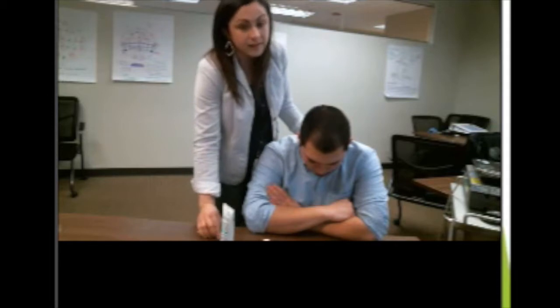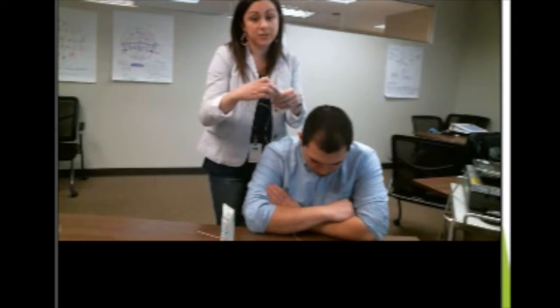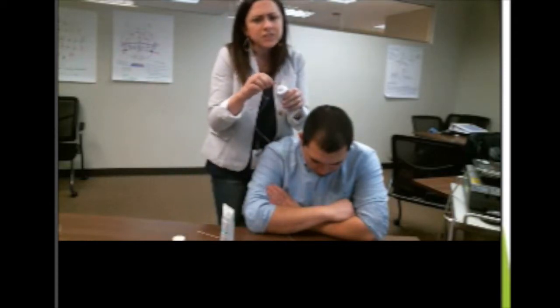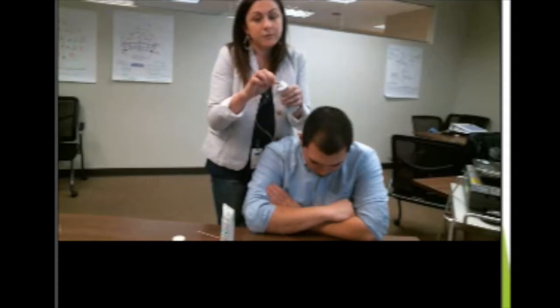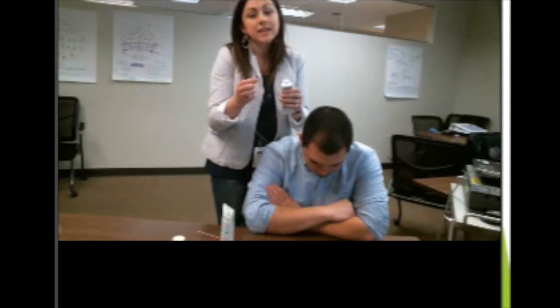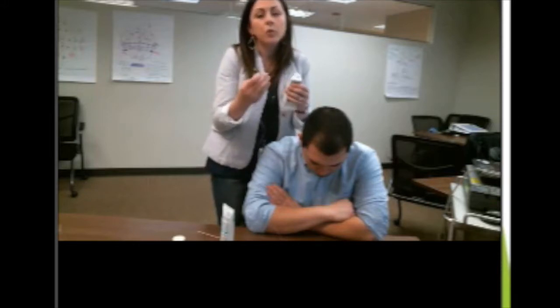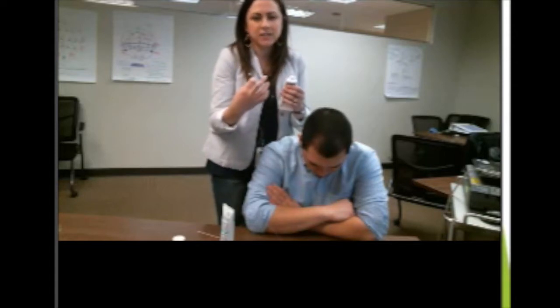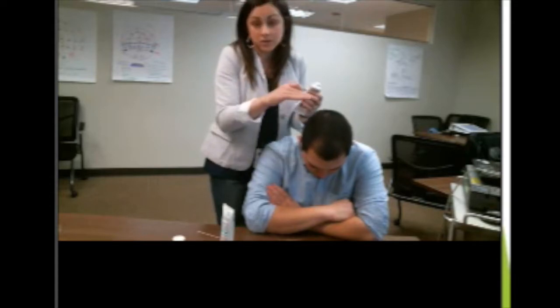Next, I'll apply my conductant paste to the gold cup electrode itself. So we'll scoop the paste into the gold cup electrode just enough to fill the cup. We don't need a heaping scoop, just a level scoop. And remember, this is conductant paste, so any electrical activity that it's exposed to will be conducted to the electrode. So we don't want a large area of paste — we only want the paste directly underneath the electrode itself on the area that we marked on the scalp.